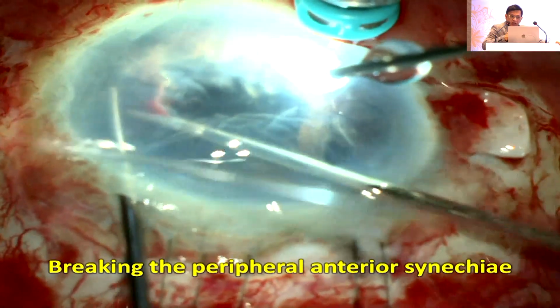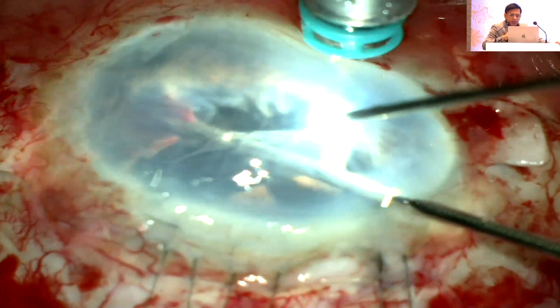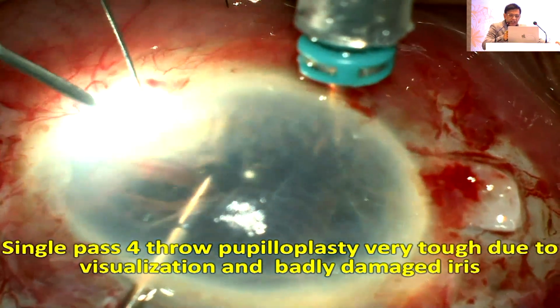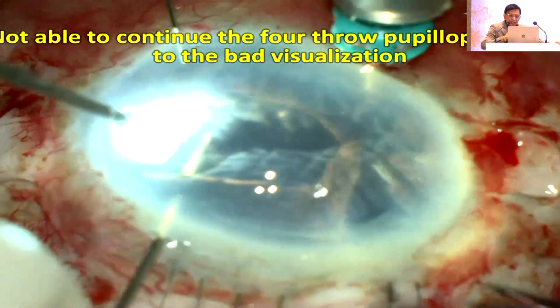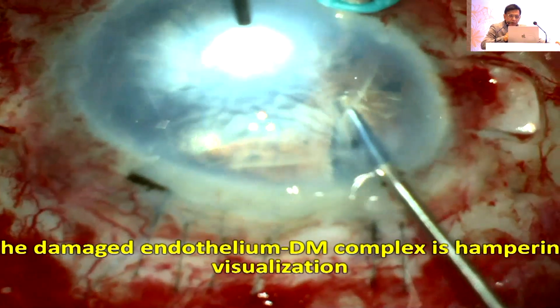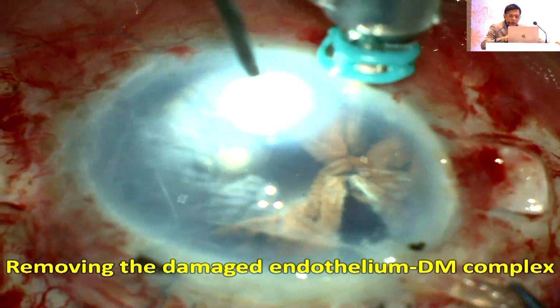This portion is done. Now when I start at the other side, I'm breaking the peripheral anterior synechiae. I'm trying to do it, but I just am not able to continue because of the visualization problem. So I thought, let me stop for some time. Let me try to remove this bad endothelium Descemet's complex.